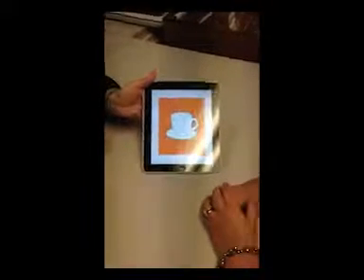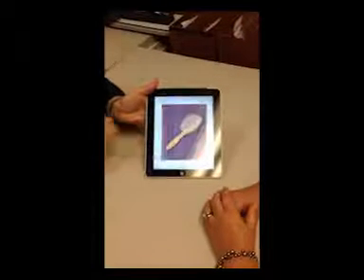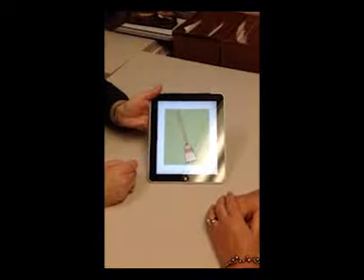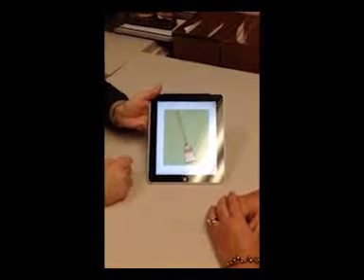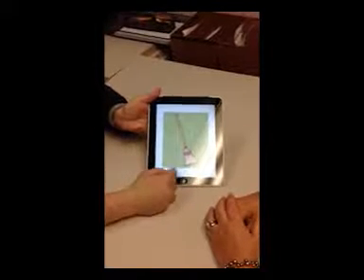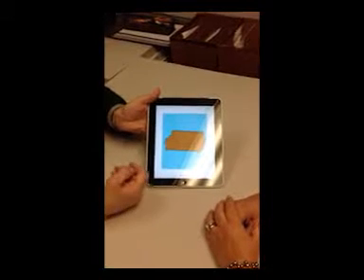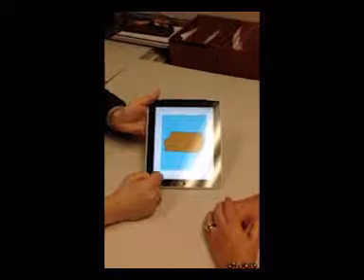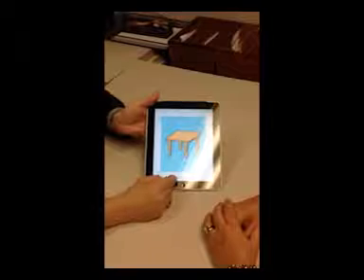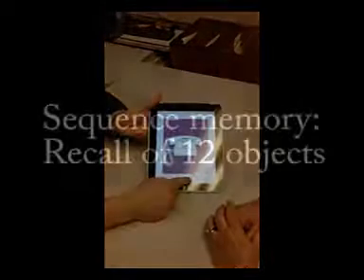Cup and saucer. I'm going to move these at about 1 every 3 seconds. Lamp, brush, refrigerator, broom. Now, if she told me it's something you sweep with, I would tell her, yes it is, it's called a broom. Couch, I'll accept sofa, divan, almost any word that works for the patient is fine as long as it actually represents the object. Teapot, table, stove, telephone. Okay, very good.